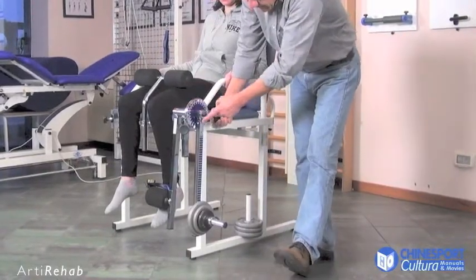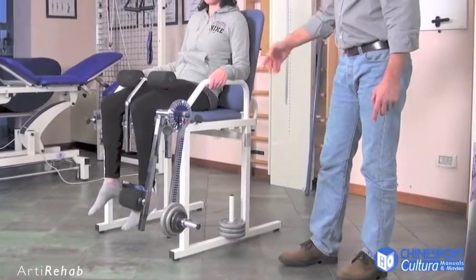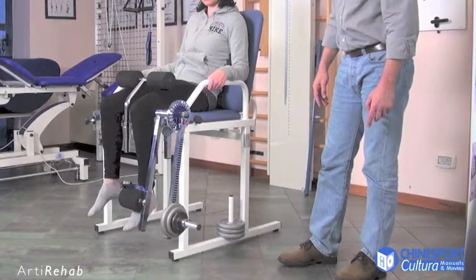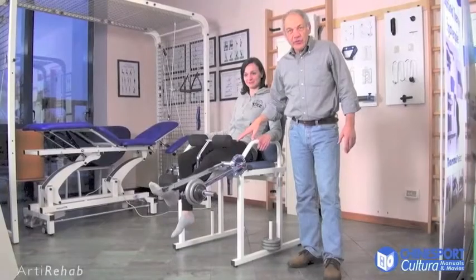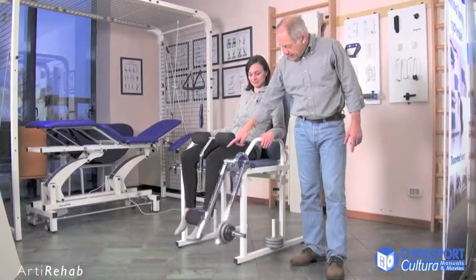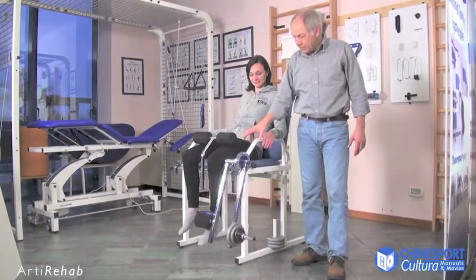At this point, having decided on the working angle, the patient can begin the exercise. This is Arty Rehab's classical function: extending the leg determined by contraction of the quadricep, termed concentric contraction.